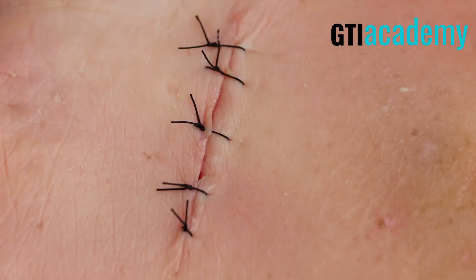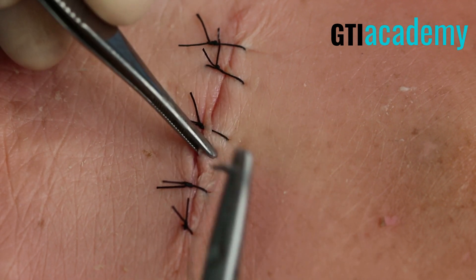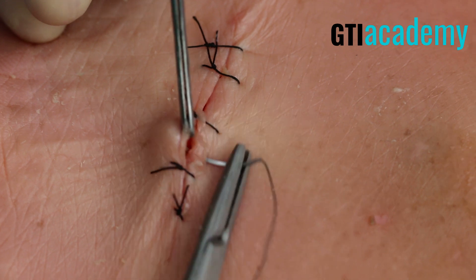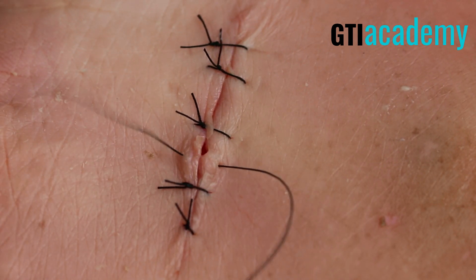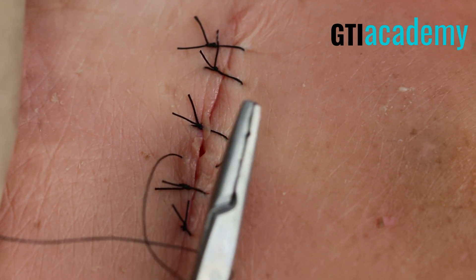As you can see, just a few more areas that aren't well approximated — two, three, four — so we'll address right here in these two large spaces. Remember, simple interrupted suture is really for wounds that don't have a lot of tension on them and are superficial, not really deep. This wound actually is very perfect for that.